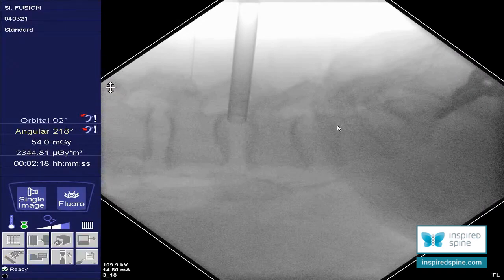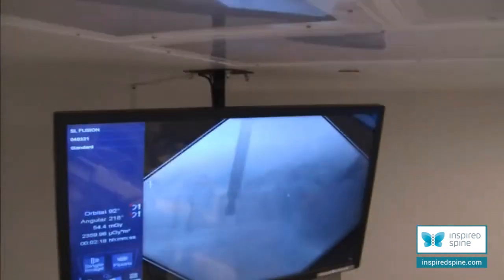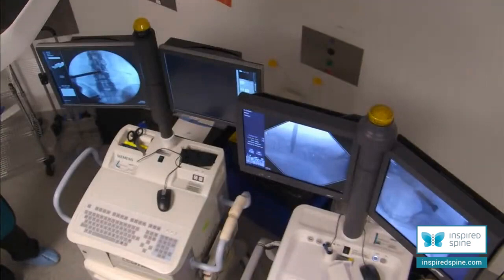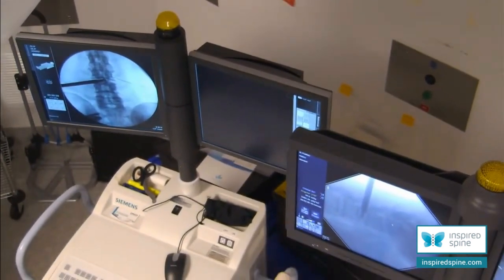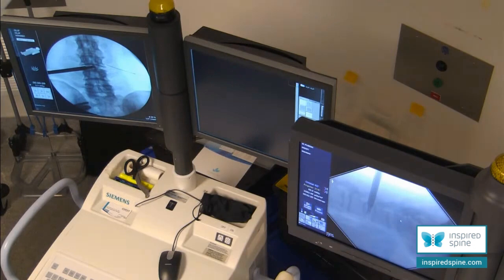X-ray. So you're not shooting the laterals for me — please, always shoot the lateral. X-ray. X-ray. And Doug has been in the surgery — this is truly the flow of the surgery, no different. X-ray. X-ray. This is a real bad disc — this is a normal disc, so it is much harder to do this on a normal disc because the tissue is more viable. In a bad disc, tissue falls apart.